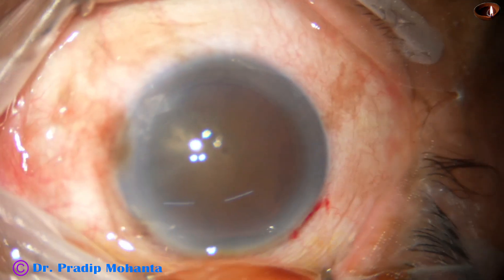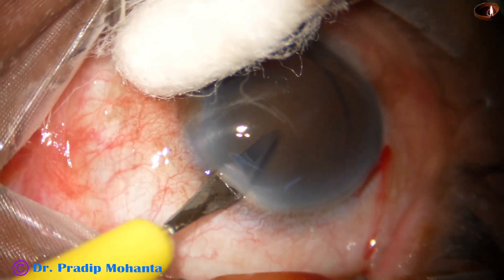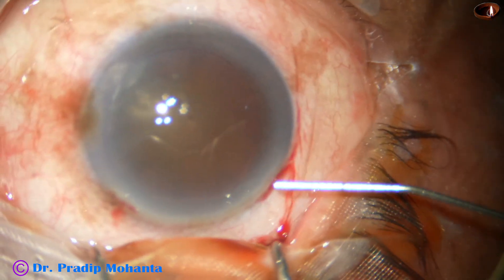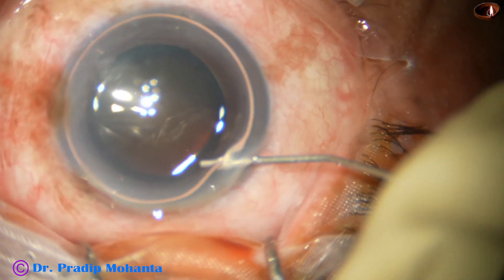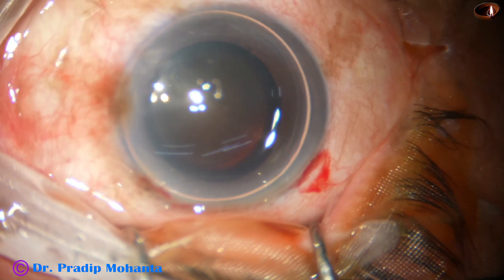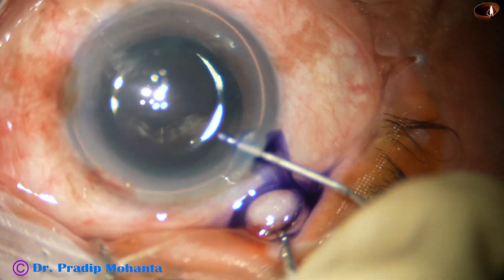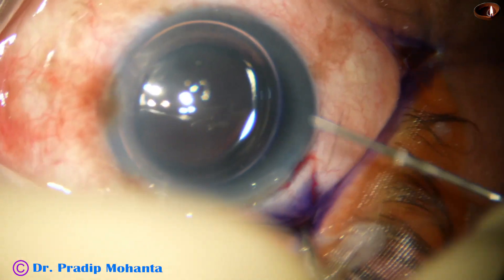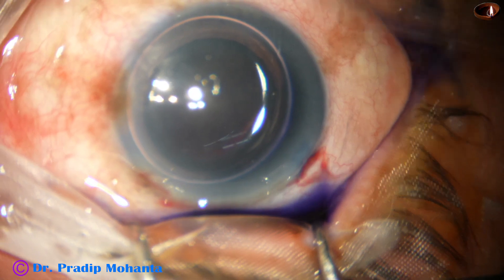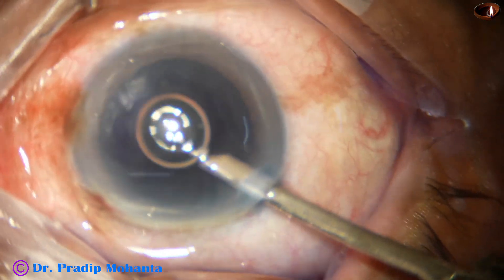This is a hard cataract — nuclear sclerosis is about grade 5. By this time the main incision and the side port has been made. An air bubble is injected into the anterior chamber and then trypan blue dye is applied over the anterior capsule underneath this air bubble. Staining is very fast and very nice — in about 15 to 20 seconds if we stain the capsule underneath an air bubble.